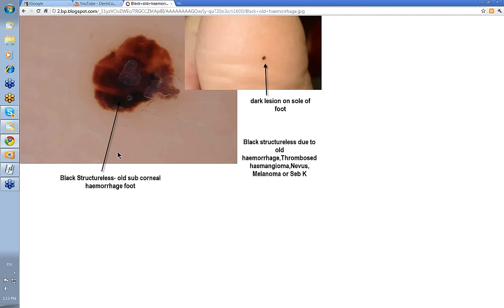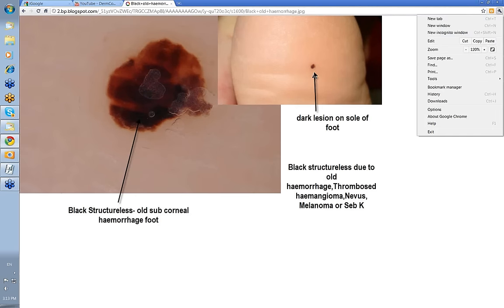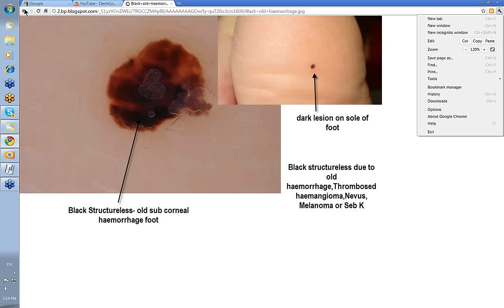Here's another black Structureless case — this is on the sole of the foot. It's a solitary lesion, and yet with the dermatoscope you've got this black Structureless area. This was old subcorneal hemorrhage — and of course if you take a blade and trim it, it will all just disappear. So black Structureless differentials: old hemorrhage, thrombosed hemangioma, nevus, melanoma, or seborrheic keratosis.